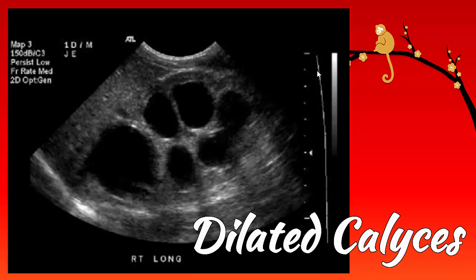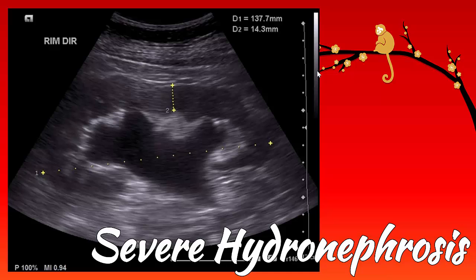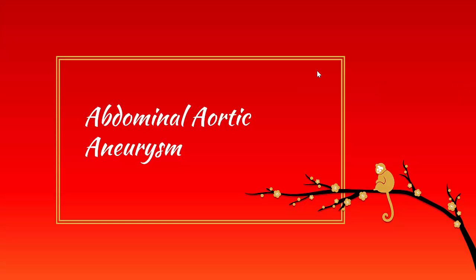You can see those dilated calyces within the renal pelvis. In case you can't find those black puddles, there they are. There are 3 more behind those. Here's another example of more severe hydronephrosis. You can see those puddles have coalesced. And additionally, you can see that there is some evidence of thinning of the cortex, which is consistent with severe hydronephrosis.